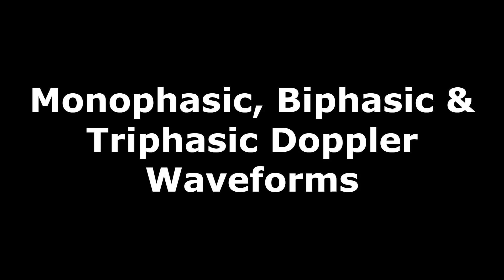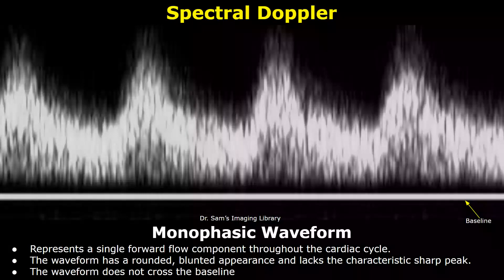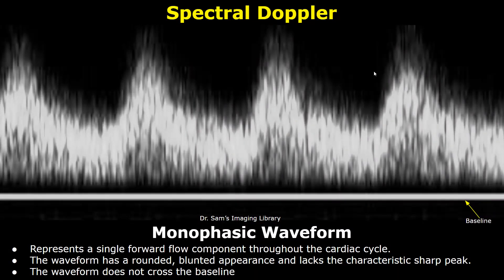Hello everyone, this is Dr. Sam. This video is about monophasic, biphasic, and triphasic Doppler waveforms. This is a spectral Doppler waveform which is seen in blood vessels during a spectral Doppler study. This line is the baseline.